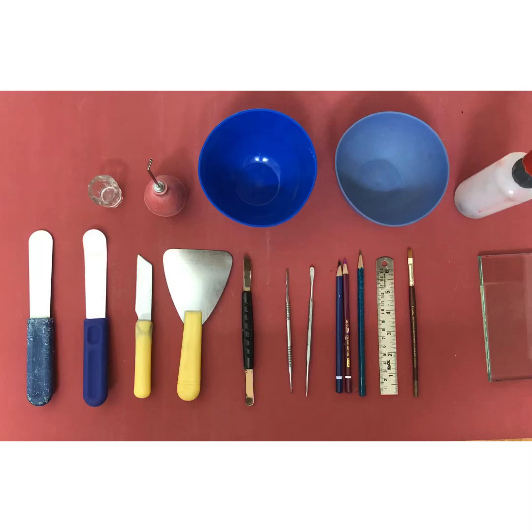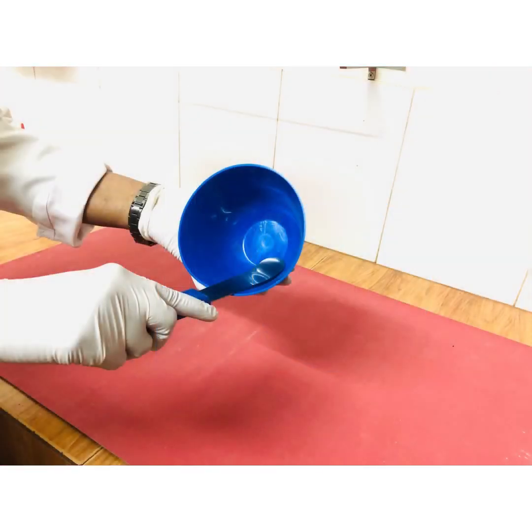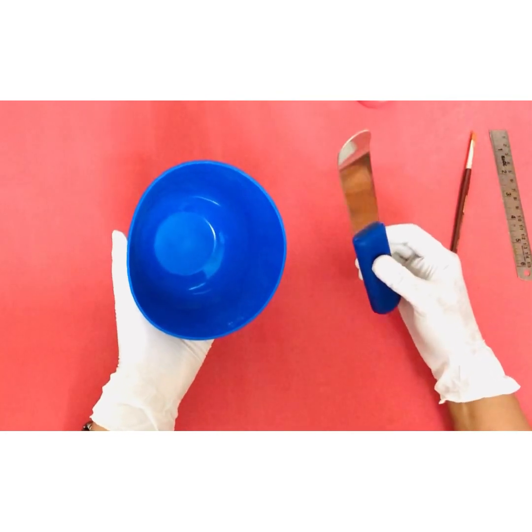Hello, good morning. Today let's go through the basic instruments we need for pre-clinical lab. This is a curved stainless steel spatula, which is used along with a flexible rubber bowl for mixing alginate impression material. Here you can see that the curved tip of the spatula adapts well to the surface of the bowl, which helps in effective manipulation of alginate. This is exactly how the bowl and the spatula will be used together while manipulating this material.